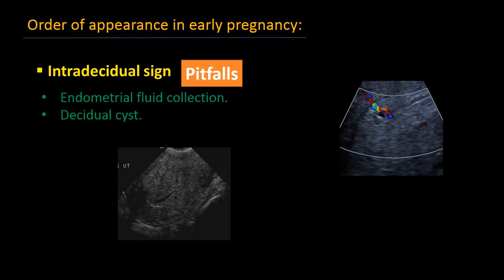There are some mimics which may be confusing. Such mimickers include intracavitary fluid and decidual cyst, which is usually located at the endometrium-myometrium junction. However, the intradecidual sac sign is close to the central white line and may have a little color flash beside it.